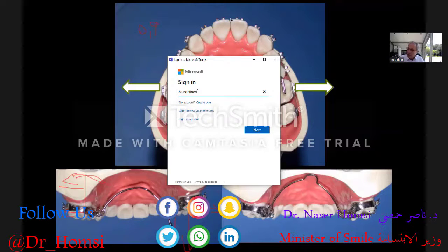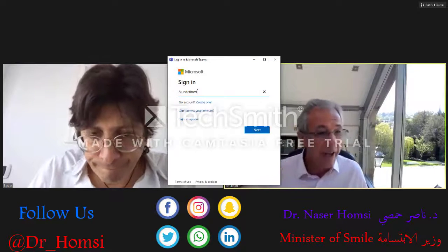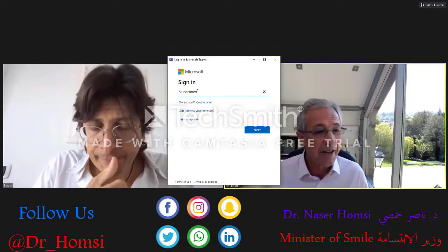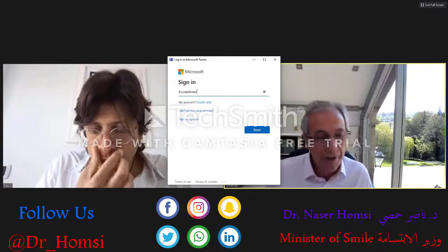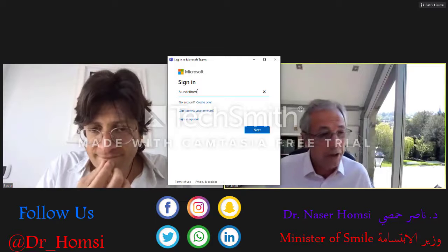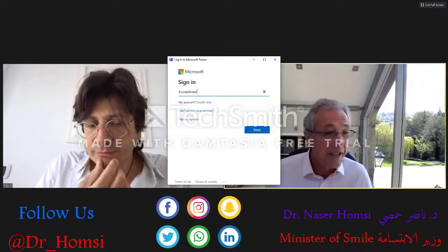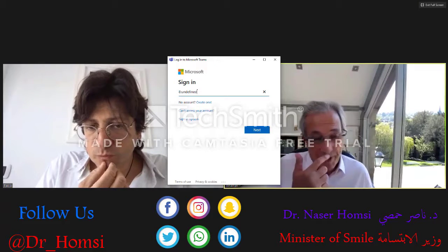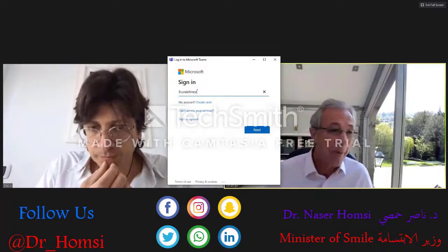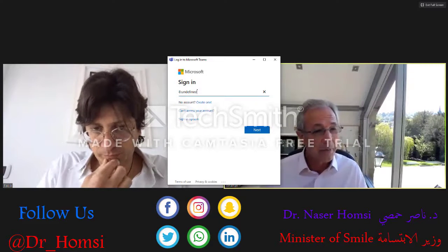In Diana, she clearly had a lot of gingival show anteriorly, and she also had a degree of vertical maxillary excess. Have you got any experience of using a temporary anchorage device in the way in which they were described in the very first paper describing TADs, which was by Creekmore and Eklund in 1983, where they put a TAD in between the roots of the upper central incisors to intrude against the screw? Have you any experience of that?